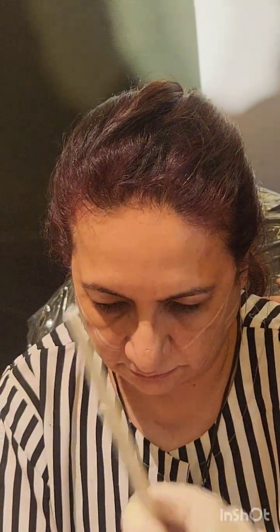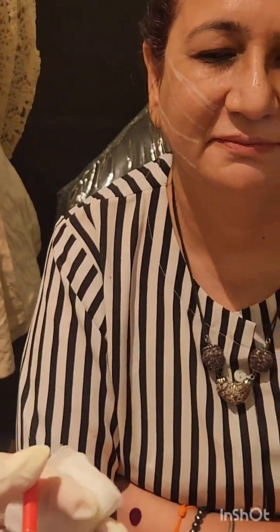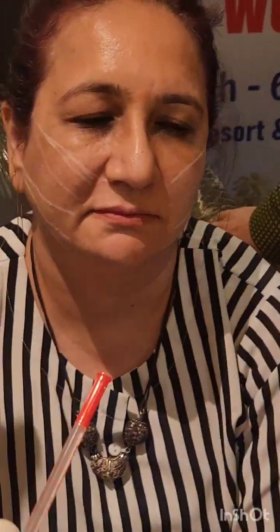Aditya, anesthesia. Are we doing the neck also for her? If not, can you show me the markings? I'll show you the markings. If Aditya permits, then I'll do the neck lift of this. I showed you a video, na? That day, neck lifting. The eye bags are there. So now I'm anesthetizing. Now nobody touches the face. Aditya, aaja.